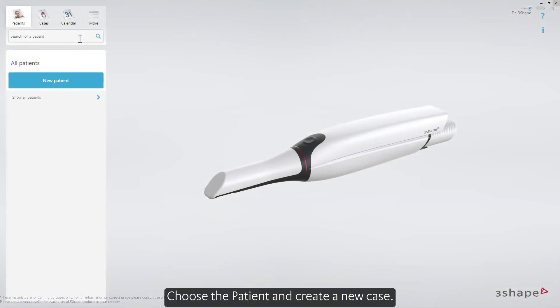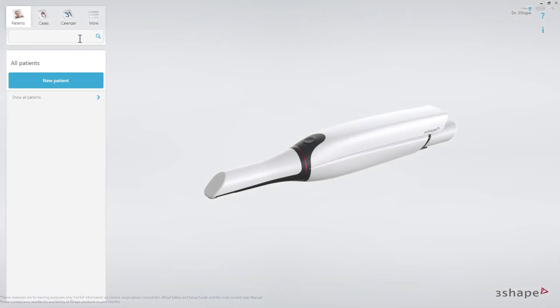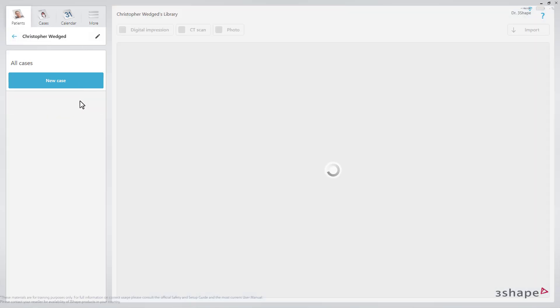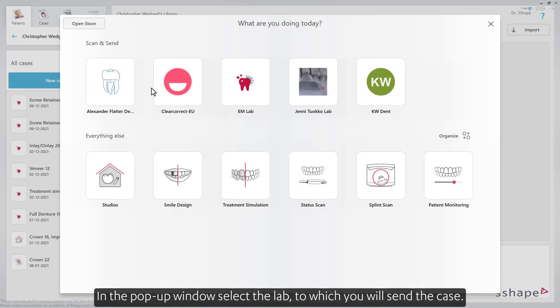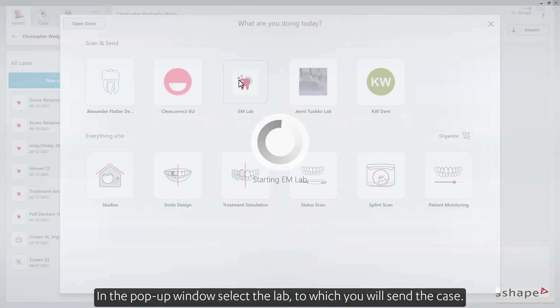Choose the patient and create a new case. In the pop-up window, select the lab to which you will send the case.